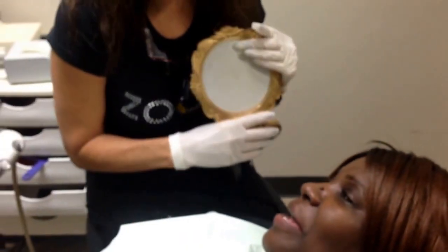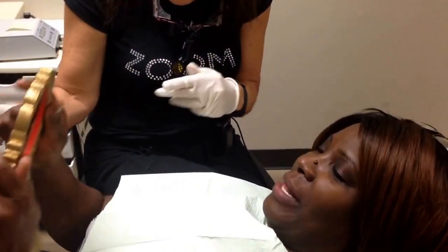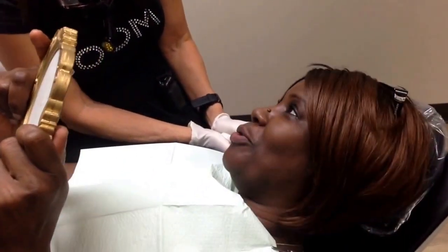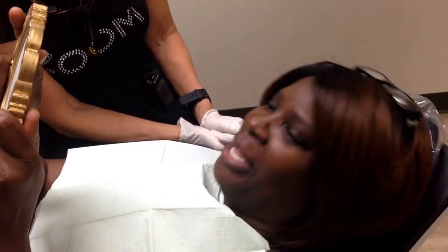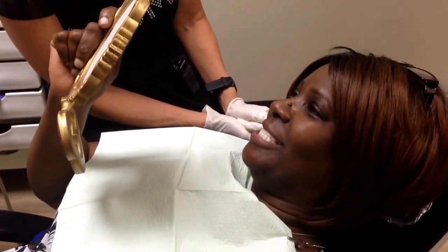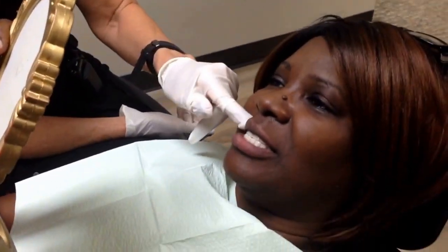I'm going to go grab a mirror. Now the patient hasn't seen these. So are you ready for the big reveal? Yes, I am. Go ahead and take a look. Oh my goodness. Thank you so much. They look good, don't they? They do. And what about the color? It's close. I like the color. It's very close. Everything looks natural. Looks natural, doesn't it?